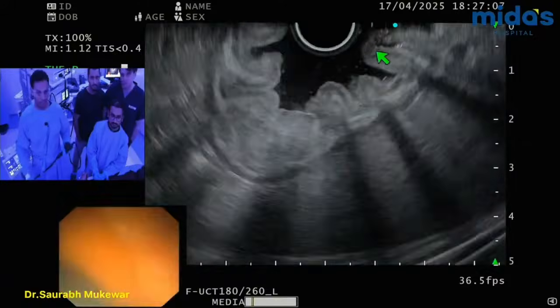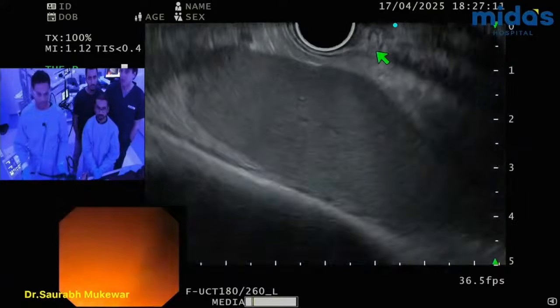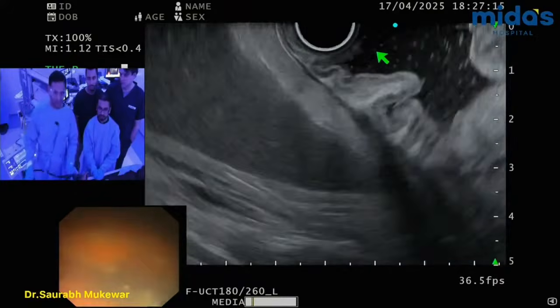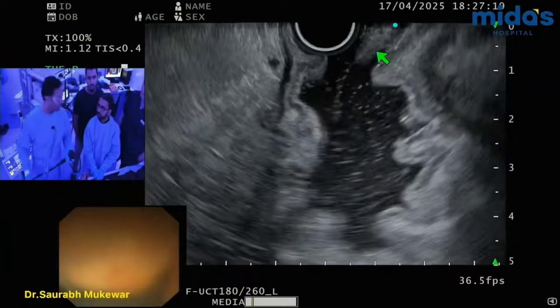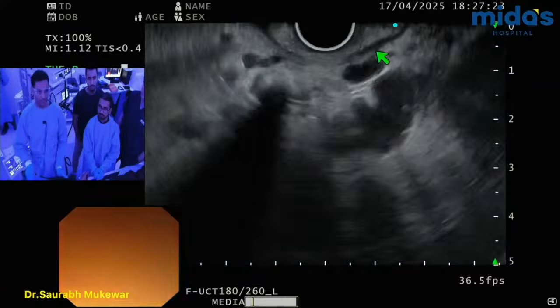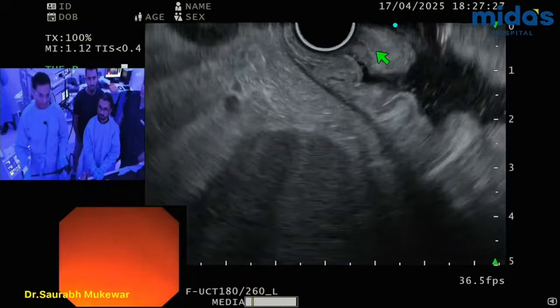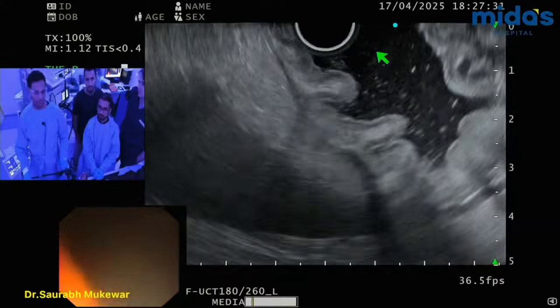Well, I mean, if he's bleeding and you know it's from gastric varices, unless it's a spurter, spurting in front of your eyes, then you want to just go and fix it, right? But if you have some time and you know it's bled, like in this case last night, or you go and see there's a sign it may have bled from there, it's not actively spurting in your face, then you just take your time and do it the way you want to do it.